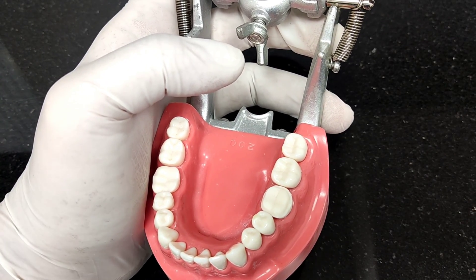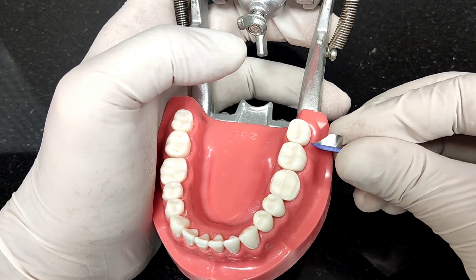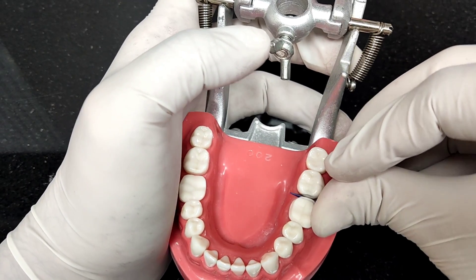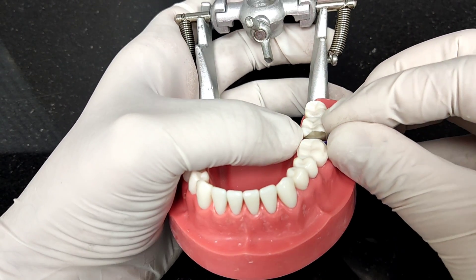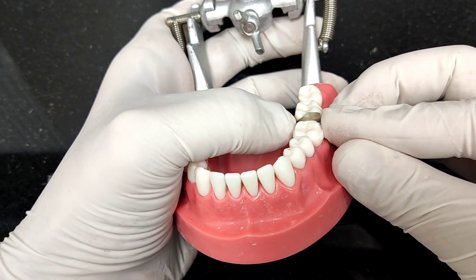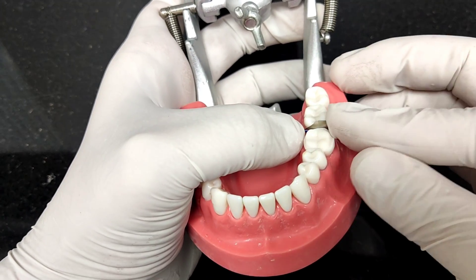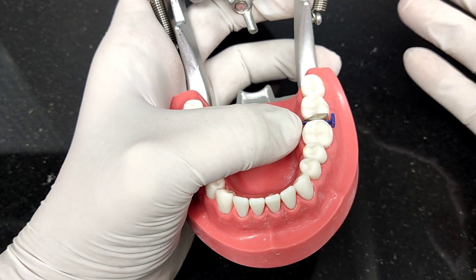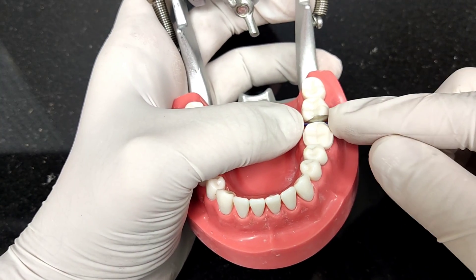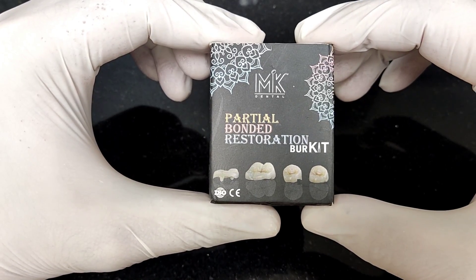A common question is: how do I prevent adjacent teeth from being nicked during tooth preparation? The answer is simple — use fender wedges. Plug these in; they not only separate the teeth but the matrix extending above will protect the adjacent tooth from any form of trauma. Put one on the distal and one on the mesial, go ahead and prep, and don't worry about the adjacent tooth — the fender wedge is protecting it.